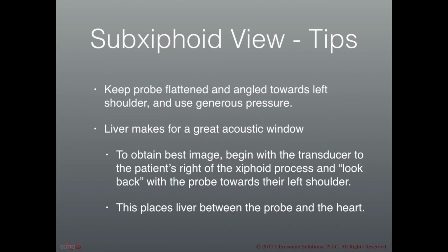Some tips to obtaining the subxiphoid view: you really want to keep the probe flat, which often means your hand has to be above the probe. It needs to be pushed down with a fair amount of pressure, which can sometimes make this a bit uncomfortable. And then the most important thing to remember is that you want the liver between the probe and the heart to get the best acoustic window.